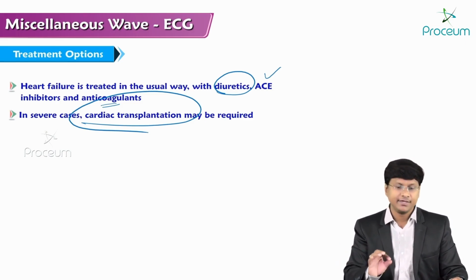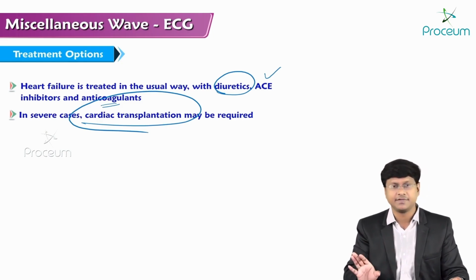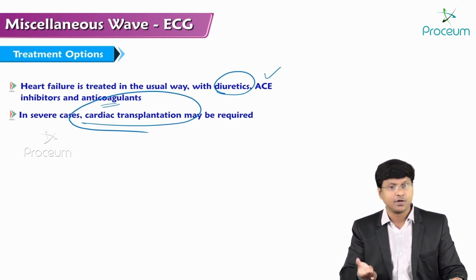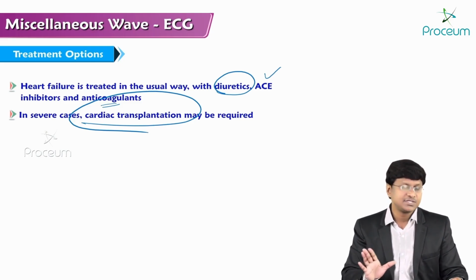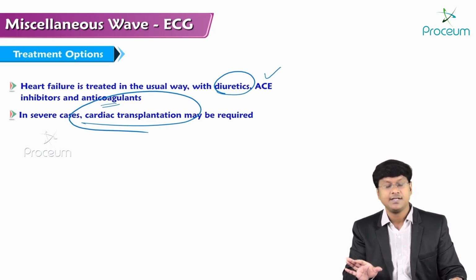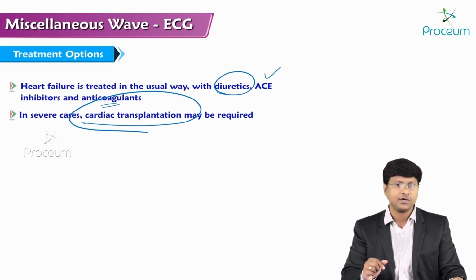How will you diagnose? Diagnosis is mainly clinical and then the investigations. On ECG, you have the presence of the Epsilon wave, which is nothing but a blip at the end of the QRS complex. And apart from the Epsilon wave, there can be T wave inversions, prolonged S wave, localized QRS widening, and there can be even VT as well, that is ventricular tachycardia. And 2D echo will be the first line investigation that will show you the presence of a hypokinetic right ventricle, and there will be prominent apical trabeculae and dilatation of the right ventricular outflow tract.